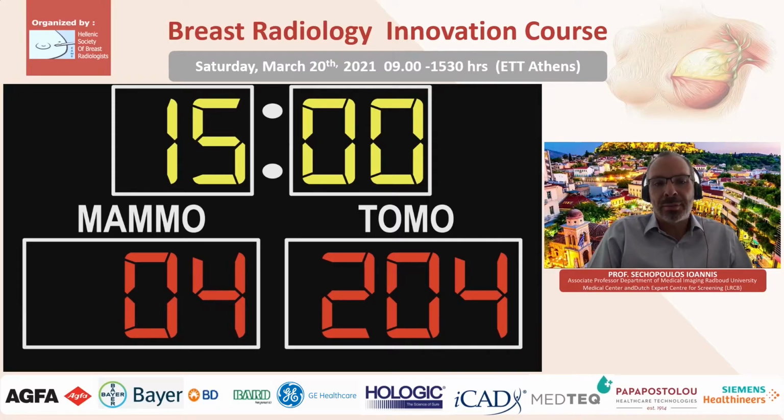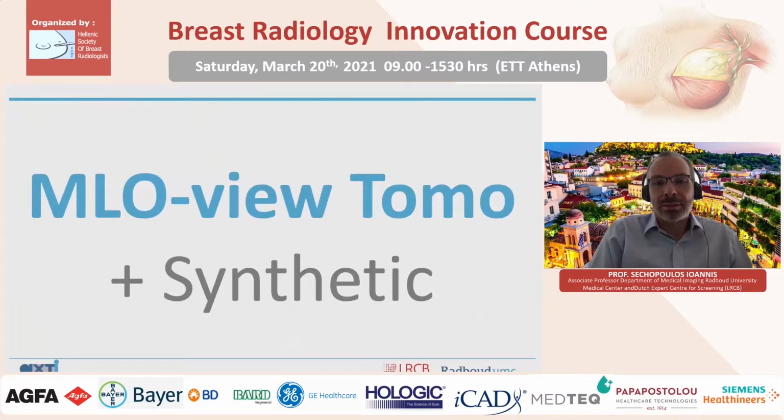So how am I going to approach this? Well, let's see, there's various options. One of them, that there's been at least a few trials looking at, is that we can read a tomo exam that's only MLO view acquisition, and we don't need the CC view, and of course, probably with a synthetic.